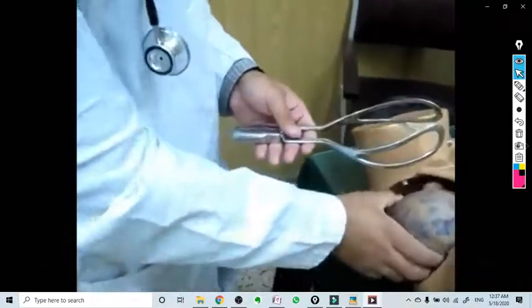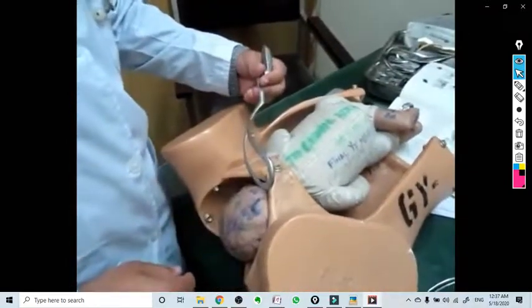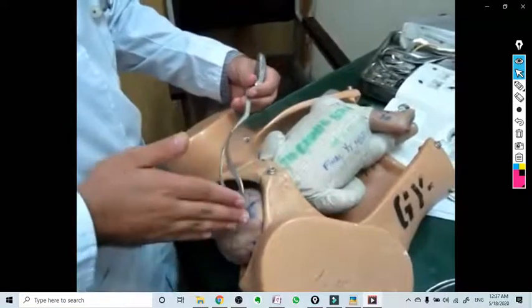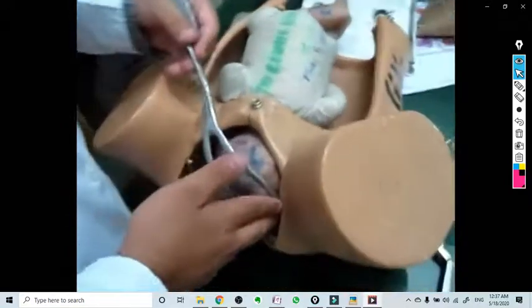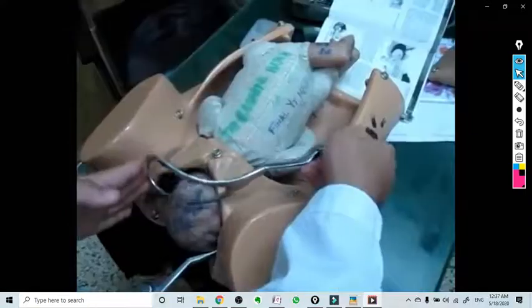Application of the blades is done one by one, starting from the left blade. The left blade should be applied first with this technique — have a hand behind the forceps to minimize injury to the perineum.